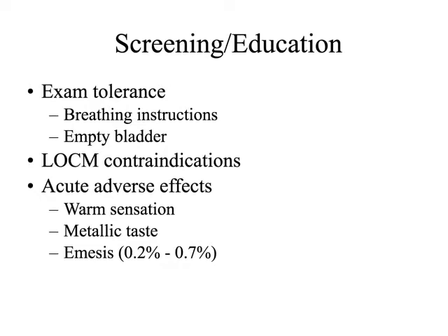We're going to be pushing it pretty fast, right? So I'll let them know that I'm going to start an IV. I'm going to be testing that IV quite a bit. I want you to let me know if at any point the IV starts to become incredibly painful, right? They need to know that. And then, of course, the important thing is just for them to hold still.